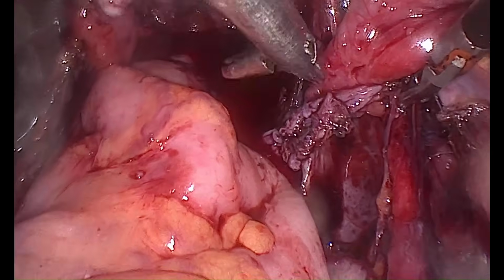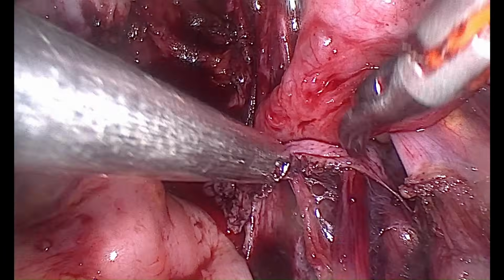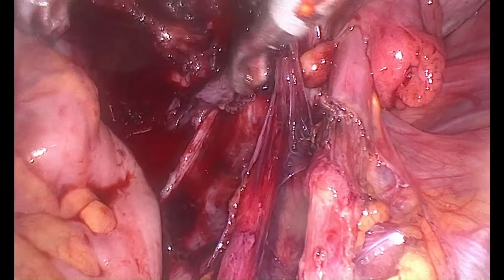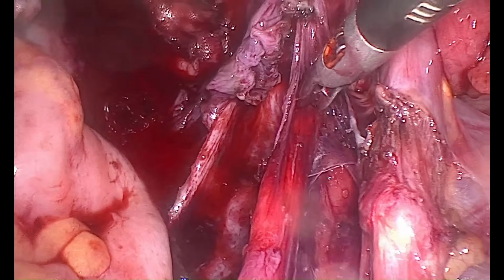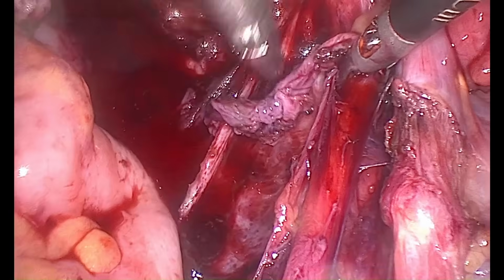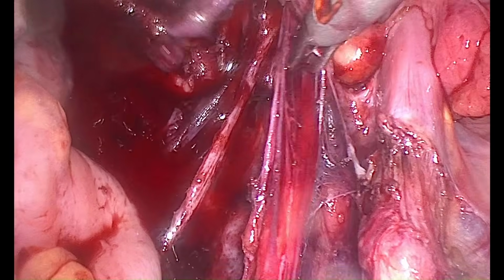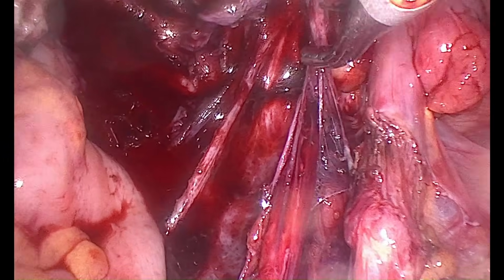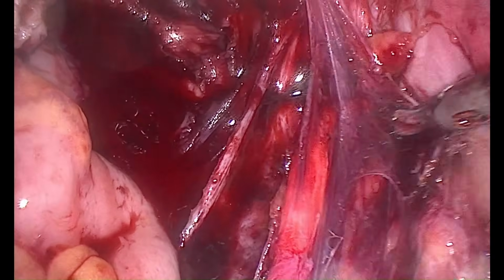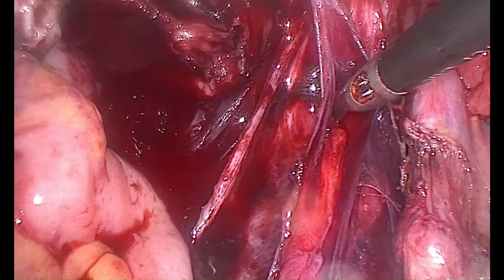You can see this is the puckered peritoneum which has been documented here in this case, and we are going to go deeper down, and as I always talk about, it should be parallel to the vital structure. So if I am doing a parallel dissection, my dissection will be very smooth. I am going to hold the needle holder in a way that this particular space is going to get opened, and you can see there are the puckering strands, and if I dissect, I am just giving the traction. You can see the whole parametrium is moving with that traction, and the ureter is puckered there.